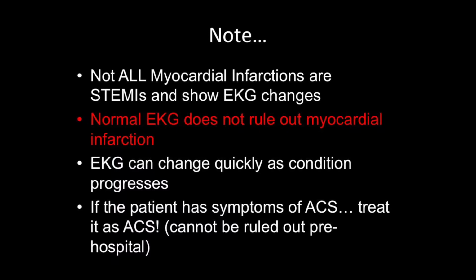Ideally. Okay. So there's some other things too, like the whole transporting piece. If one person is working on the 12 lead, the other person may be able to start prepping for the transport. I don't want that machine to become tunnel vision, that's all we do and I forget about everything else, right? Because ultimately we're there to move the person from A to B. Oxygen. Don't delay oxygen just because you're putting stickers on, right? Put them on oxygen, then put the stickers on. Or have your partner do it, or have the police officer do it, whichever.